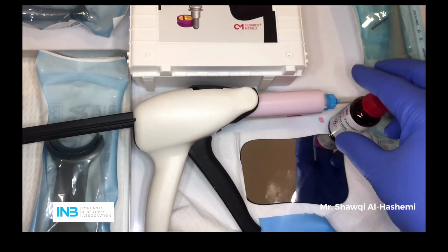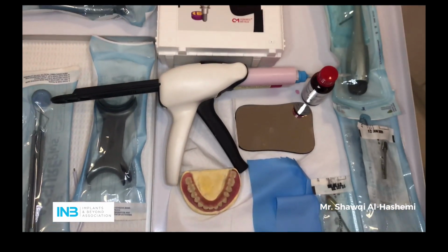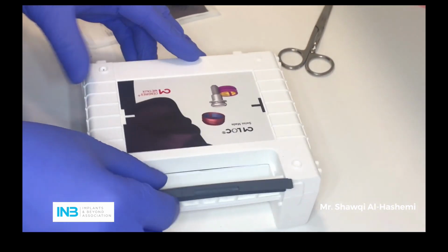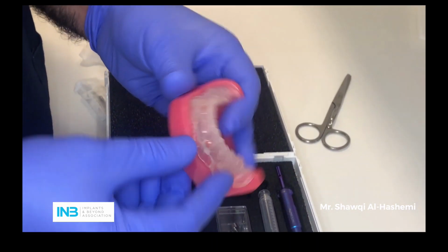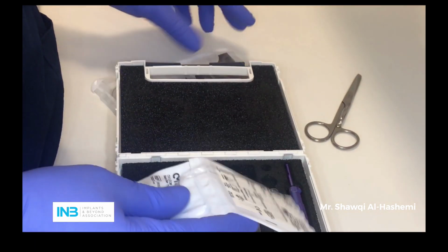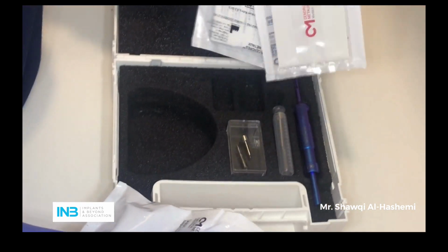Okay, and of course we mustn't forget this adhesive, which will help you to retain the cold cure acrylic. All right. Right, so we're going to demonstrate how we're going to place the CM LOC abutment on the implant. These are really good and nice and strong. As you can see, the kit comes like this. It normally comes with the demonstration, but this is only an extra bit. So it comes in a case like this. We purchased the processor, as you can see, and the locators are here, and these are abutments which will locate in the patient's mouth. So we're going to demonstrate how these are done in a second.